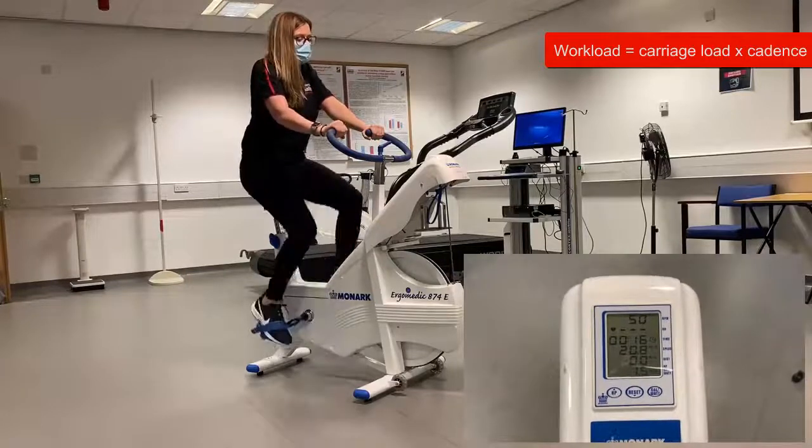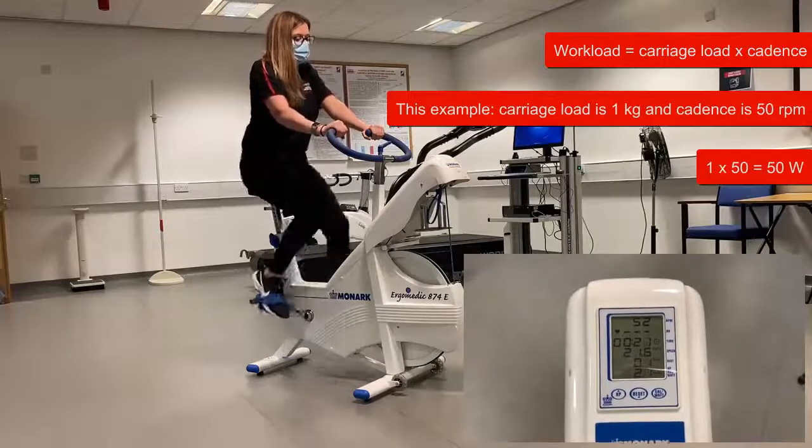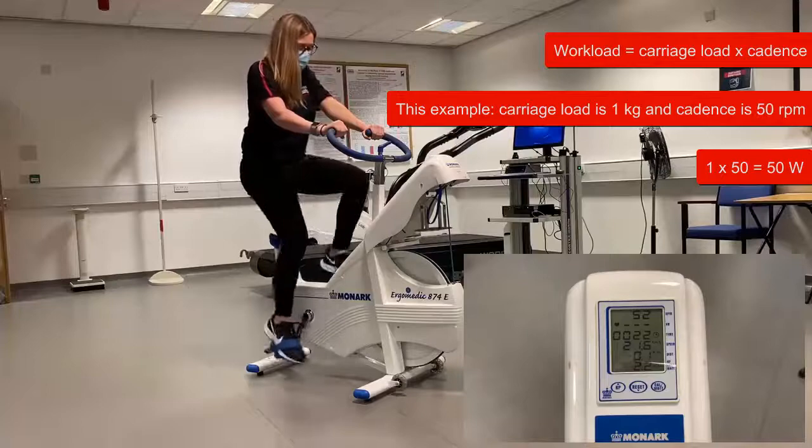Here you can see the carriage on the bike — this weighs one kilo. To calculate the workload we simply multiply the carriage load of one kilo by the cadence of 50 rpm. Here workload is therefore 50 watts.